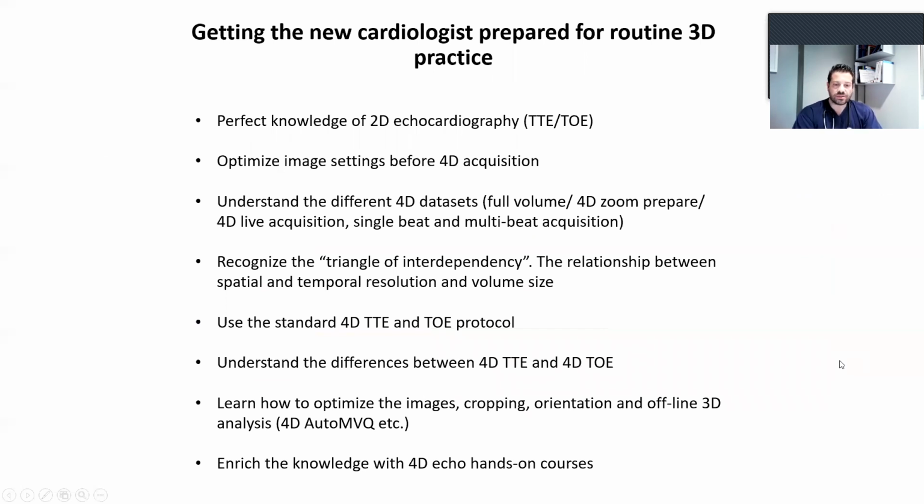For the new cardiologist that wants to input 3D echocardiography in his routine practice, we have to tell them a few things. First of all, it's very important to know how to acquire the best images in 2D echocardiography, meaning transthoracic and transesophageal as well. We have to know how to optimize our image settings before 4D acquisition.